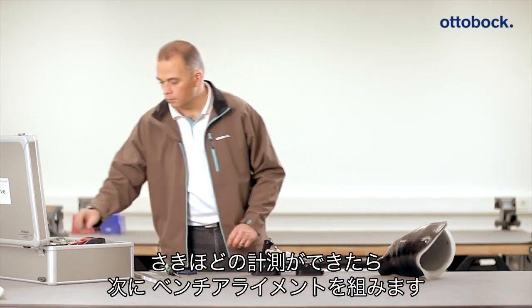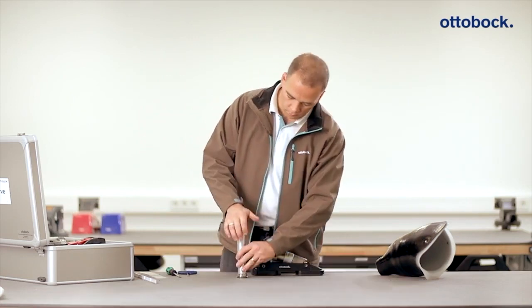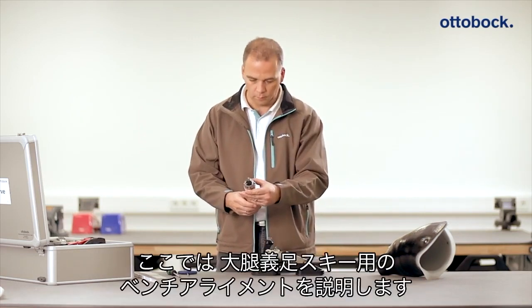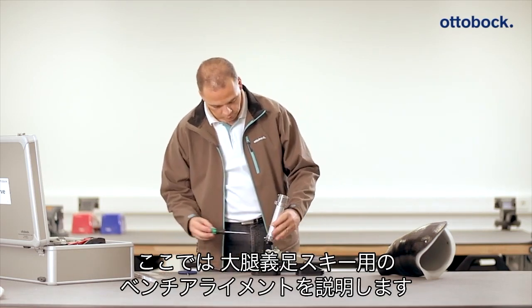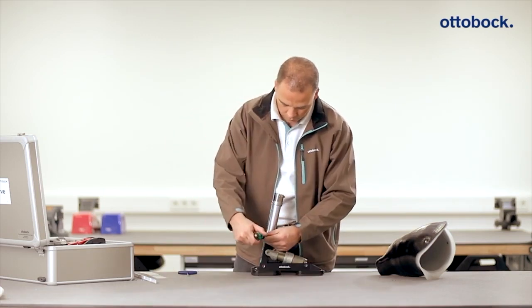After you have determined the medial tibial plateau to floor and the ischial tuberosity to floor measurements for the user, the bench alignment of the prosthesis begins. An example of this alignment is shown here for a transfemoral ski prosthesis.